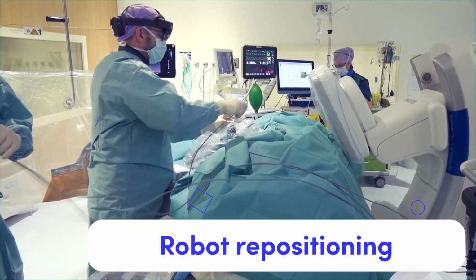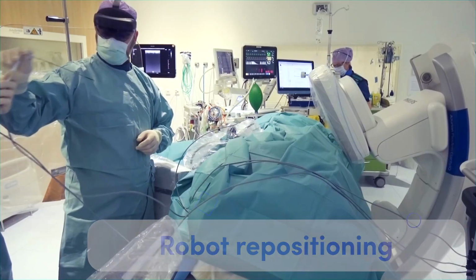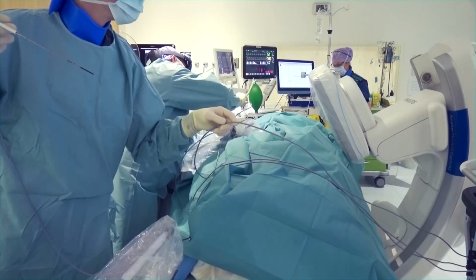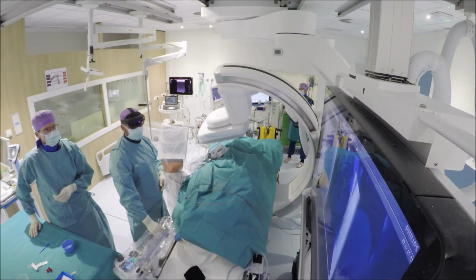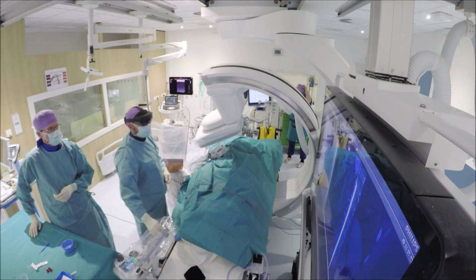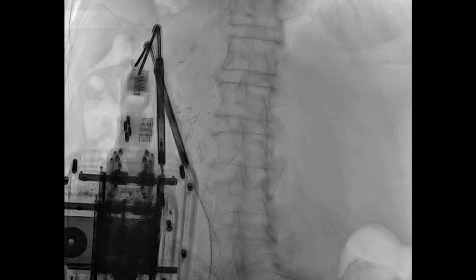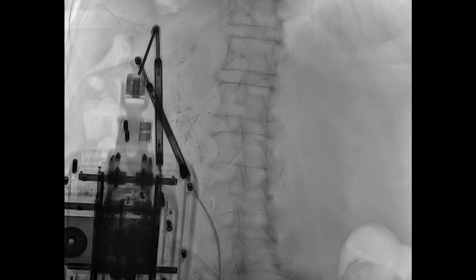We then reposition the robot for the entry point for needle number 2, which is placed in exactly the same way as needle number 1. Again, we start by using the entry point view for verifying the entry point and making sure that our robot is aligned with this entry point.